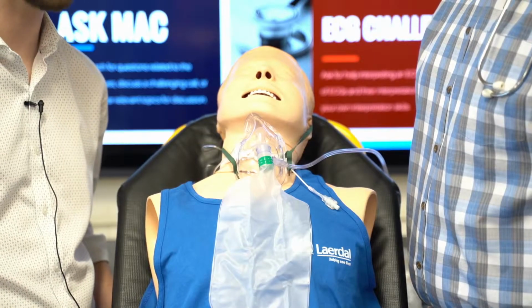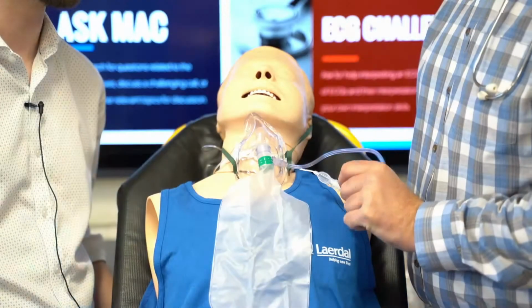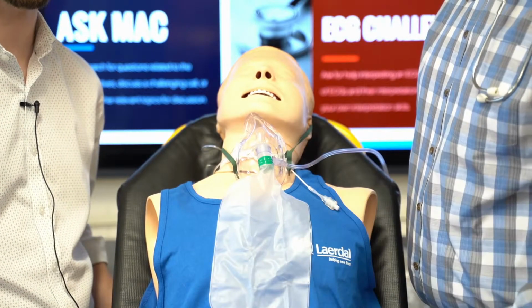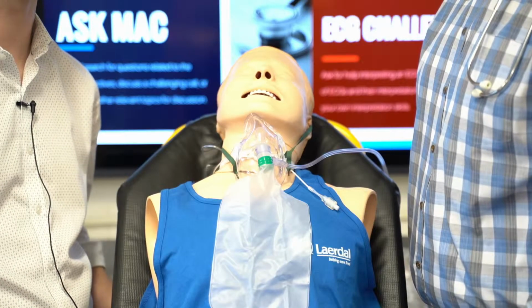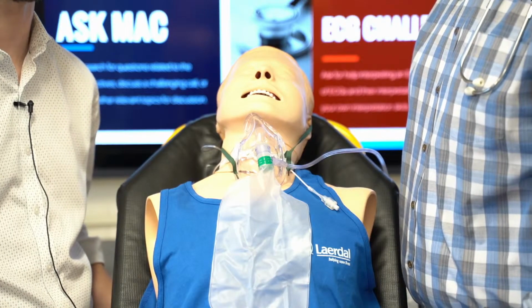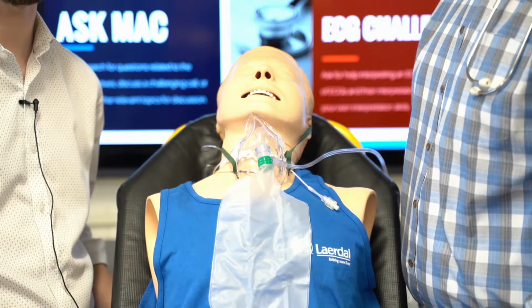With this patient, you can see that they have a pilot balloon and the cuff is not inflated at this time. That means that the patient can breathe from their oral pharynx and the stoma itself, which is why we would like to use two sources of oxygen if available. At this time though, we're just going to use one and we're going to quickly extricate to the truck.